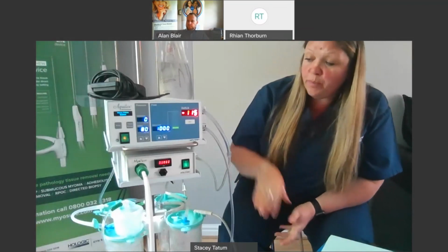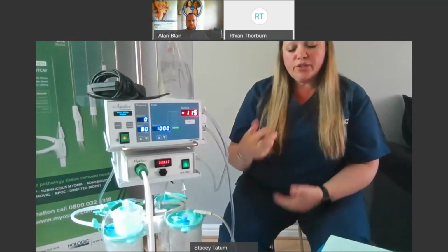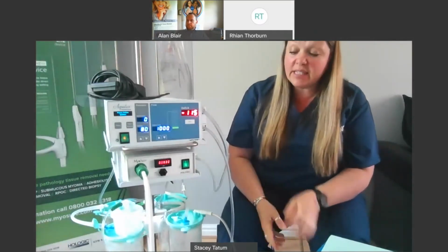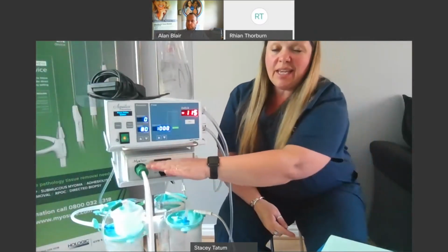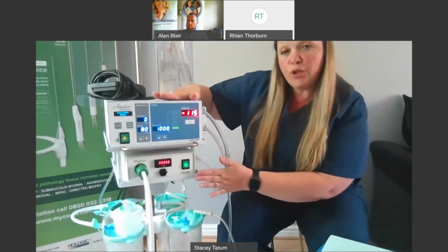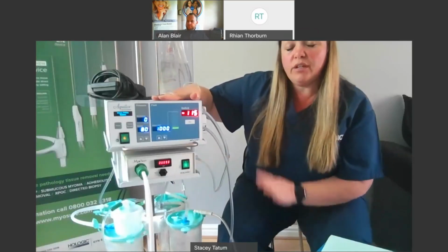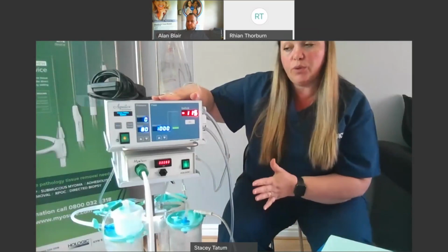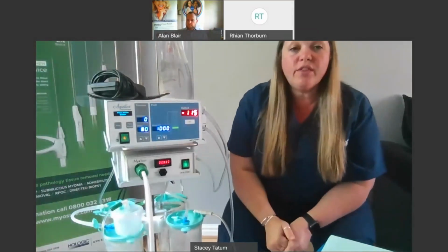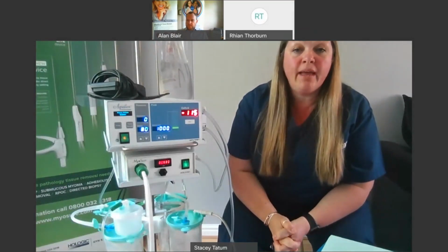And the last one would be your MyoSure controller. Sometimes, not very often, the surgeon can press the foot pedal and nothing will happen. If that is the case, turn the machine off. I like to take everything out, but please do not turn off your Aquilex. They are two separate machines. If you turn that one off, you'll have to replace all your tubing again. So leave this one on, turn this off, take everything out, give it 30 seconds, and put it all back in again, and it should work. And that's it.